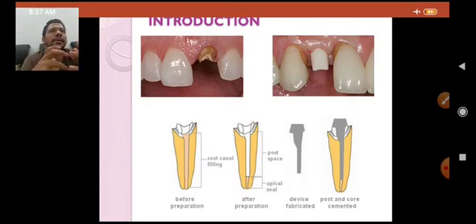The same way you reinforce a pillar with metal rods, or the same way our body is reinforced by the skeletal system, in the same manner you can reinforce a particular tooth with something called post and core, so that the longevity of the crown may be more. This is a schematic representation of a tooth which has a root canal filling, that is gutta-percha.